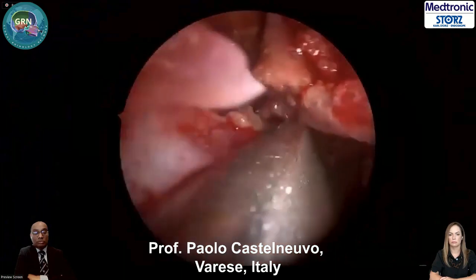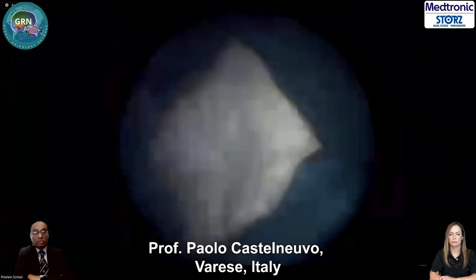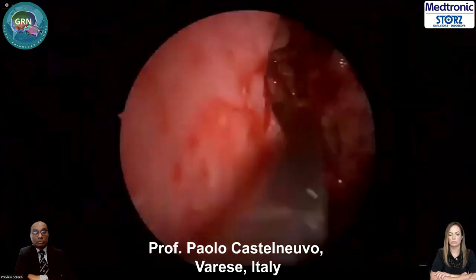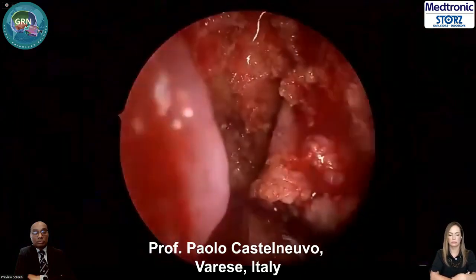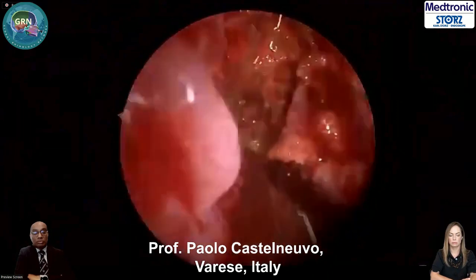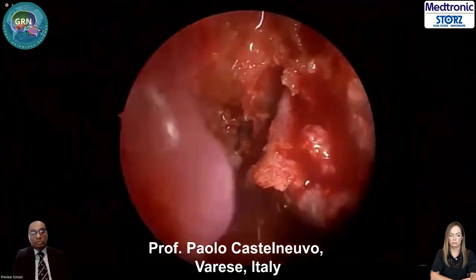Okay, this is the mucoperiosteum of the inferior meatus. Give me the chisel. Tap tap. Tap tap.